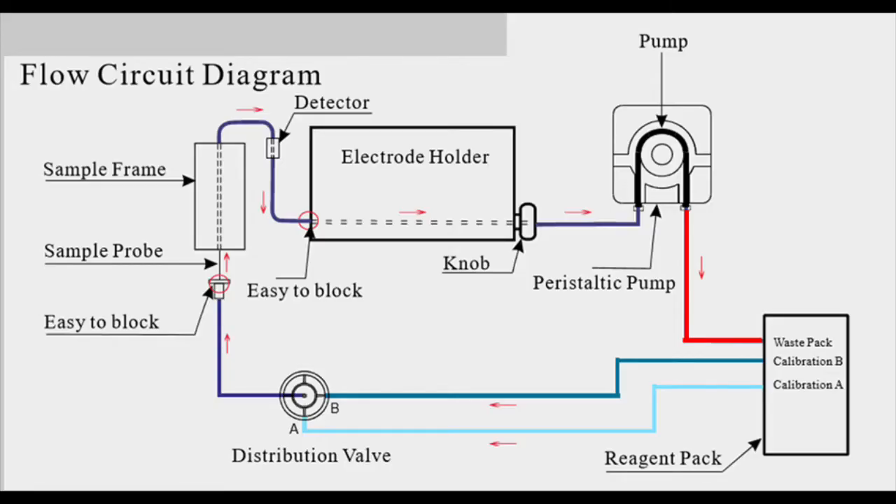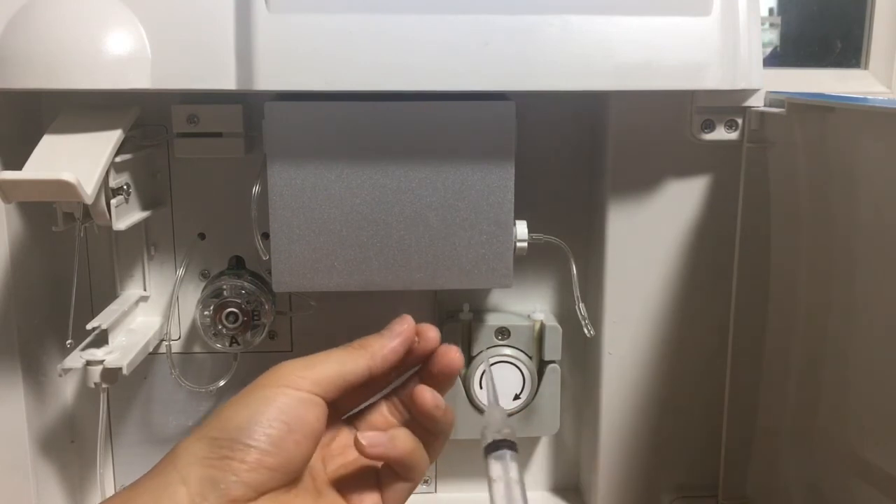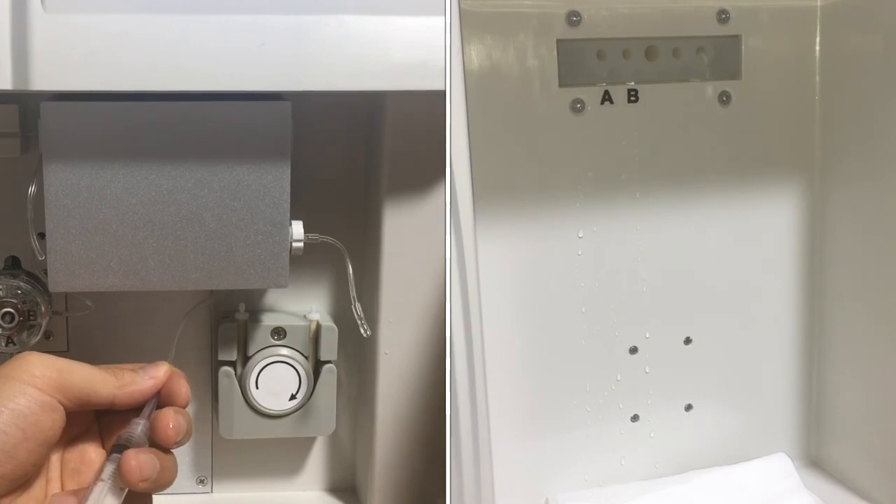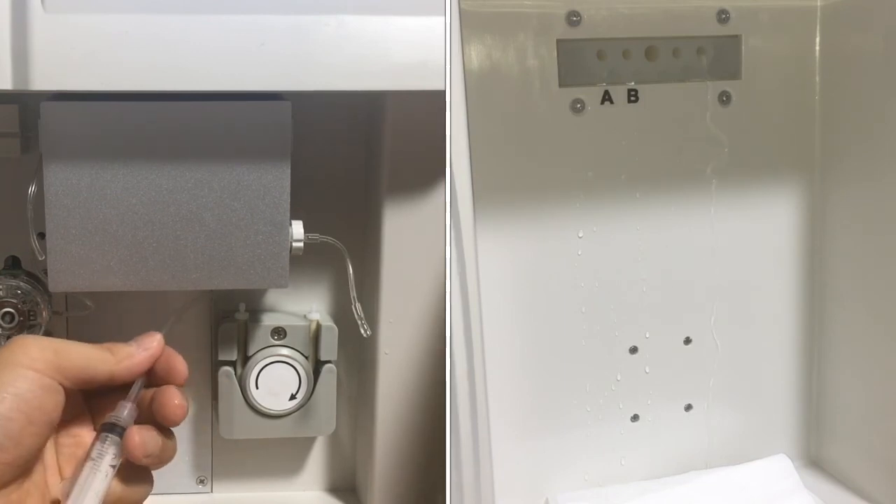At last, we remove the blockage from the pump to the waste — it's marked in red. We use the syringe to inject water from here, and we can check that the water comes out here. This means this part is okay.